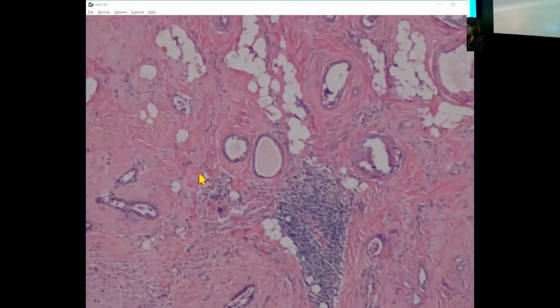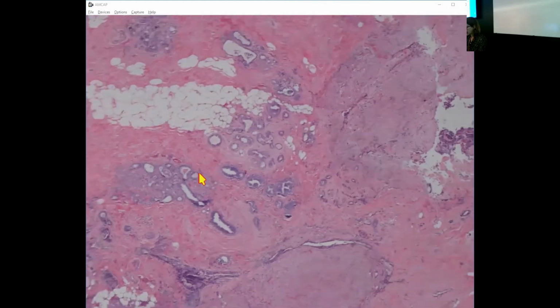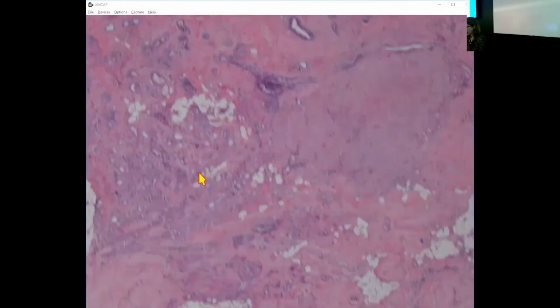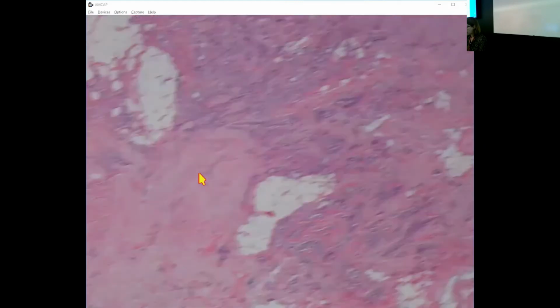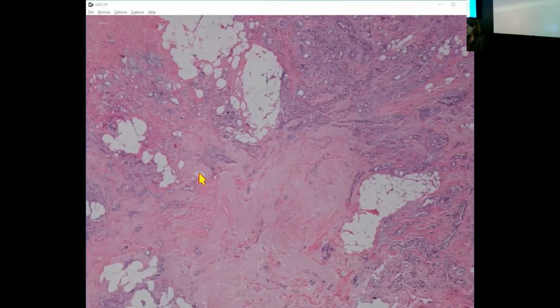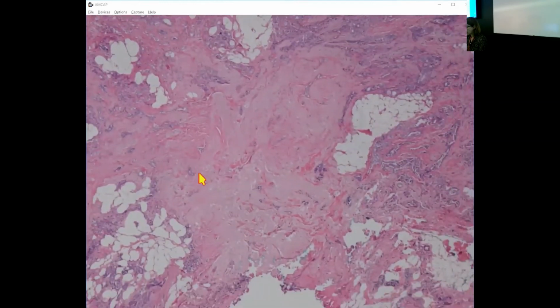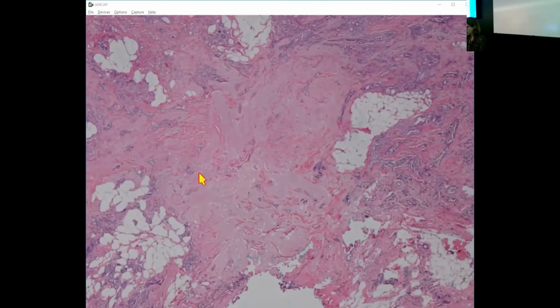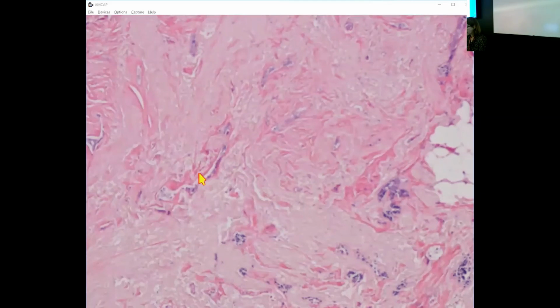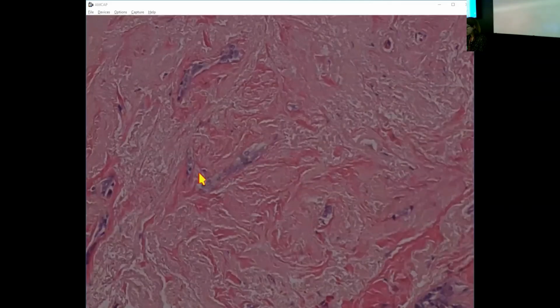It's also right beside the biopsy site, and I'll talk a little bit more about this later. But in the setting of a biopsy site, you'd want to be very careful about diagnosing invasive carcinoma without a conventional pattern of invasion. But you can see that there is an underlying complex sclerosing lesion here. You've got this fibroelastotic stroma. You've got these entrapped glands that really look like the center of a complex sclerosing lesion.